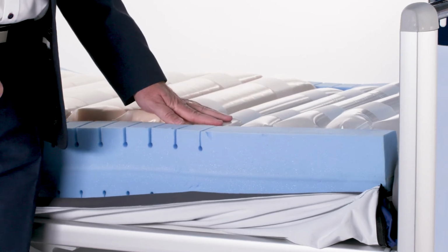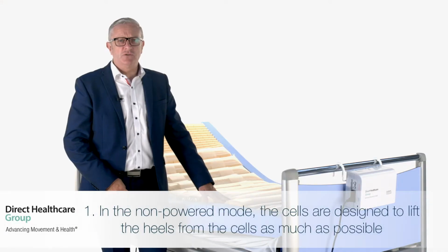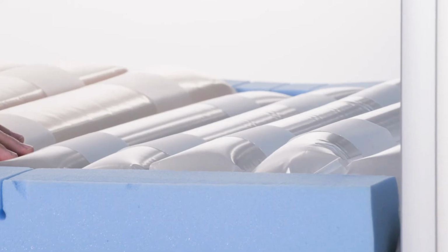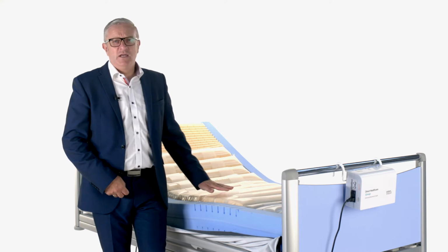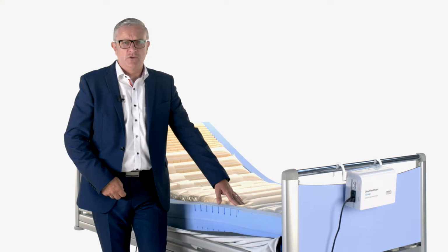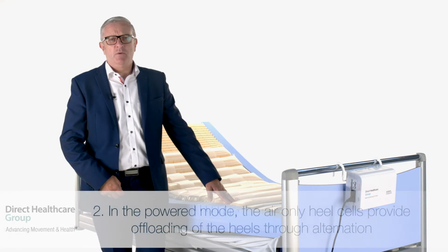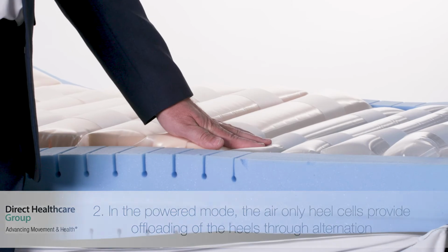These cells provide two functions. Number 1, in the non-powered mode, the cells are designed in such a way to lift the heels from the cells as much as possible. The first air-only heel cell is larger than the other 4. Therefore, when the cells inflate following body movements, this larger cell acts on the back of the calf to lift the heels slightly off the other cells, thus reducing pressure on the heels. Number 2, in the powered mode, the air-only cells provide offloading of the heels through alternation.